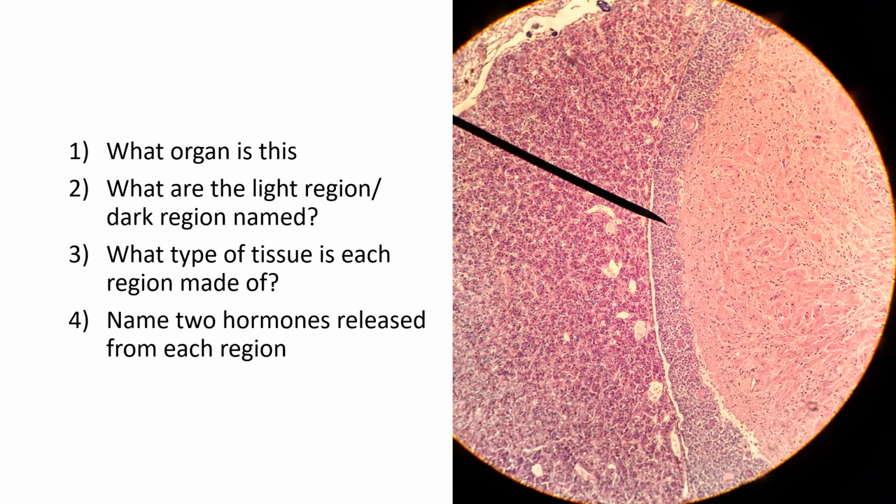All right, so here are the ones where I specifically have the questions about the structures. I'm going to do 15 seconds per slide, then change it. So pause if you need. Answers in 3, 2, 1.